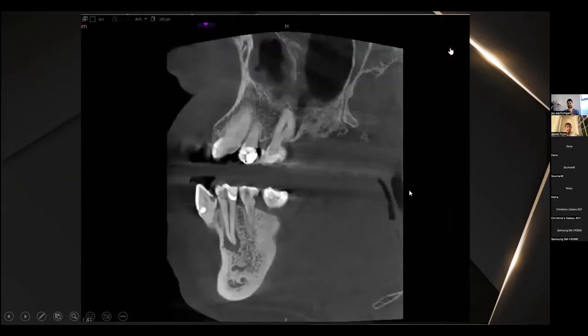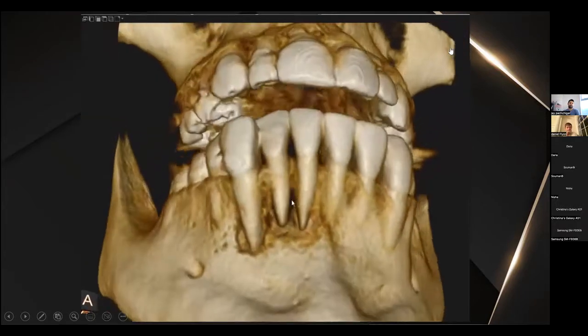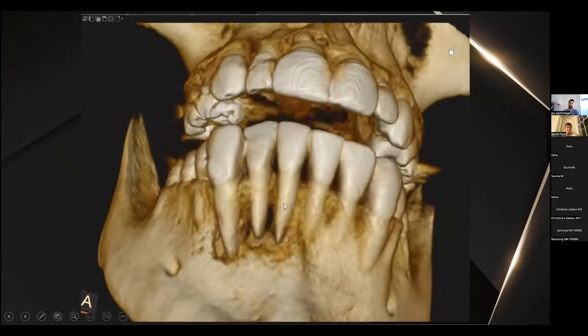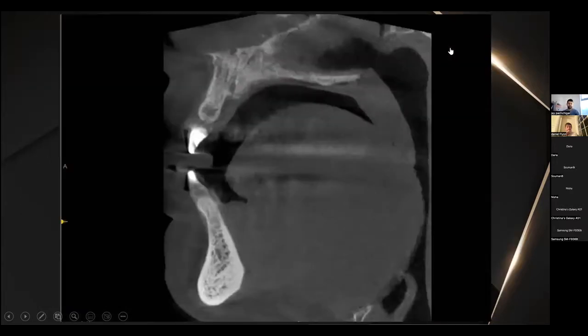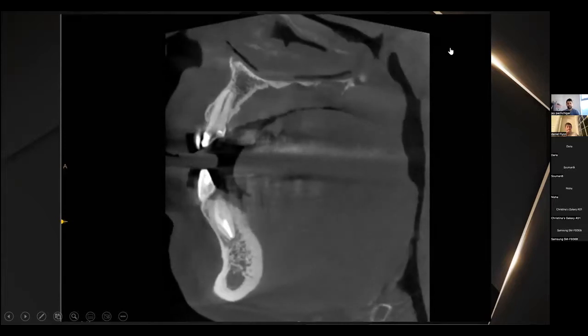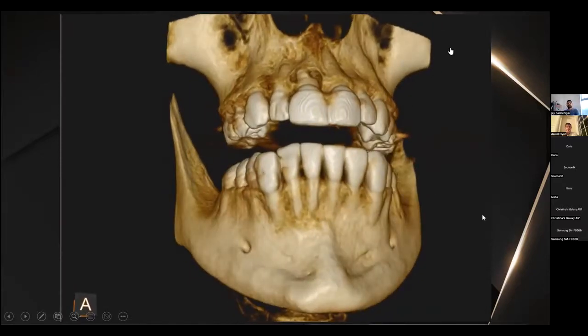This was a case where I actually treated 4 teeth, so we're looking at the 4-4 all the way to the 4-1. There were radiolucencies on all teeth, and quite a lot of bone loss on the CBCT that we took. I think this was just a screenshot of one of the sections of the CBCT. Again, a lot of bone loss. We filled them all with a bioceramic sealer. At my 6 months review, we've got almost complete healing of all these areas, and all that bone has grown back, and it is good to see these types of cases healing this fast.